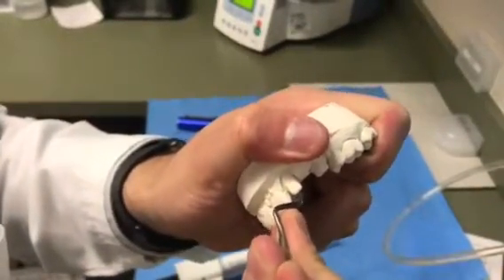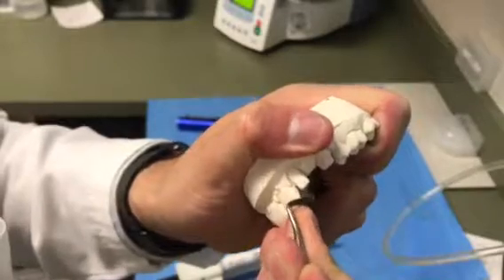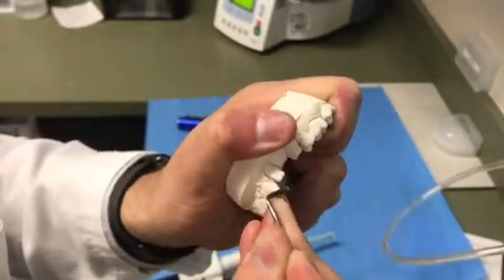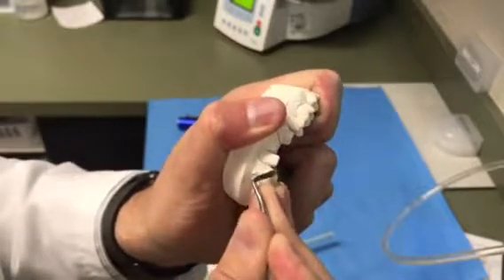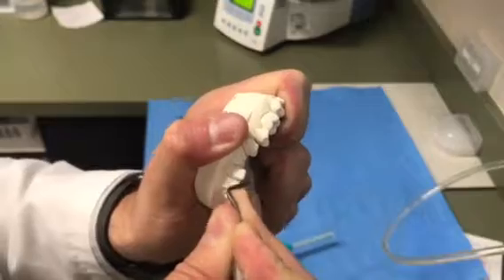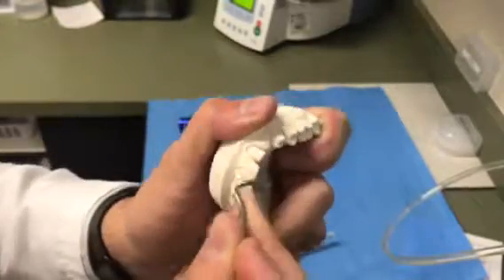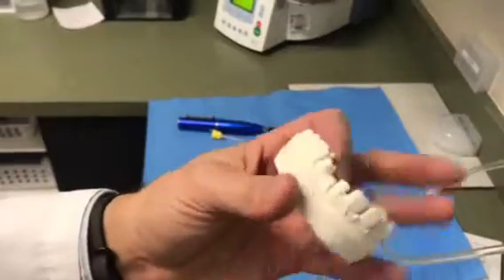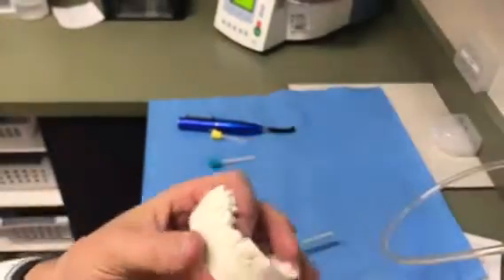So this is probably your quickest method, and it's actually pretty darn accurate. It works especially if you need to close just a little bit of space. It gives you a way to tell the lab, give me about this much space. So that's a pretty good way to do it.